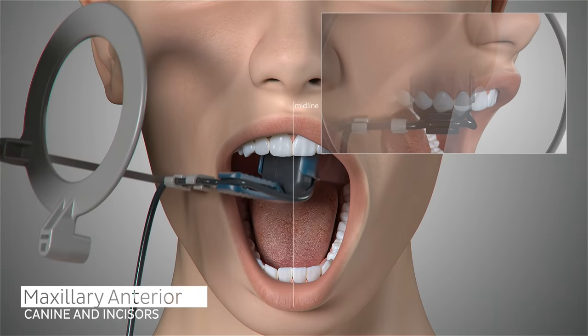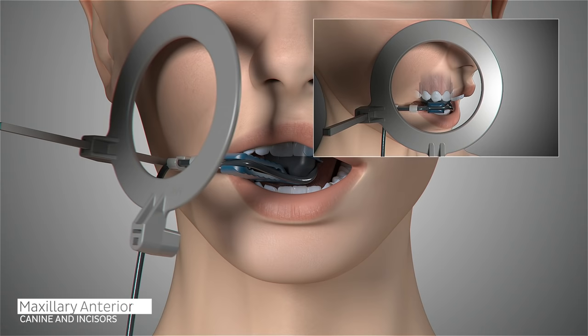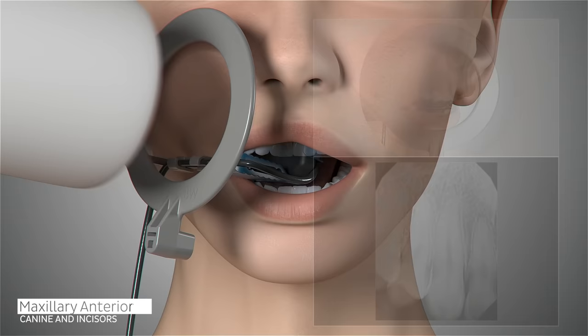We will begin by taking the maxillary right canine. Position the sensor so the canine is centered on the sensor, well into the palate and parallel to the long axis of the tooth. Ask the patient to close and slide the aiming ring as close to the patient's face as possible. The cone of the x-ray emitter must be placed flush with the aiming ring and then trigger your exposure.